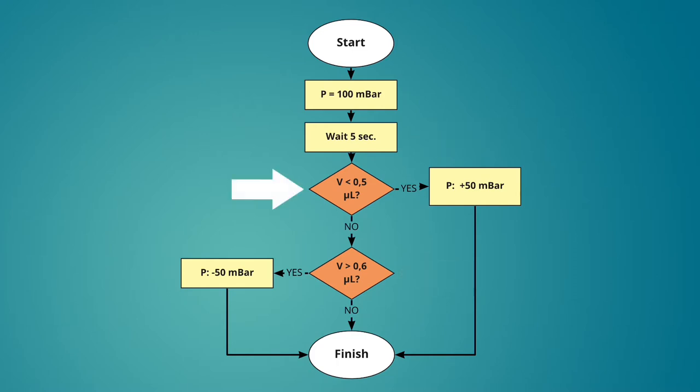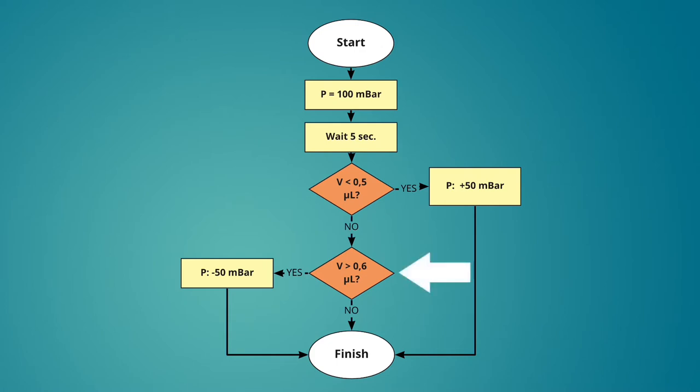If the volume is less than 0.5 microliters we will increase the pressure by 50 millibar. If the volume is greater than 0.6 microliters the protocol will reduce the pressure by 50 millibar. If both conditions are wrong and the volume is between 0.5 and 0.6 microliters the pressure will remain unchanged.